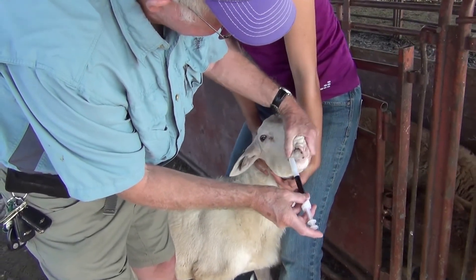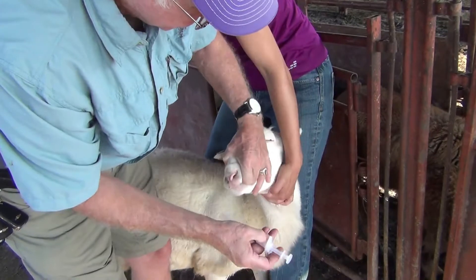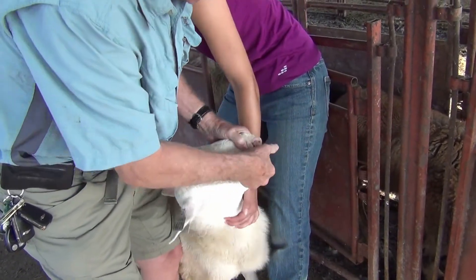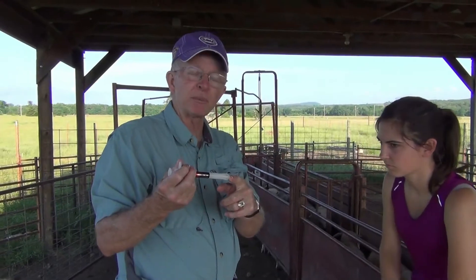I kind of split my fingers in between — don't pull it off the nose. I try to get the pill gun all the way to the back, over the back of the tongue, and then deposit the pill and pull it out. With a standard pill gun, it should be gone.